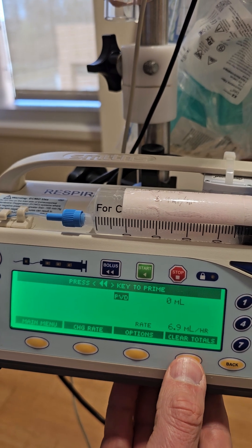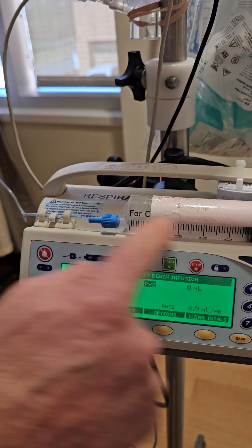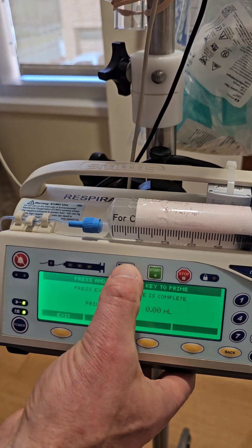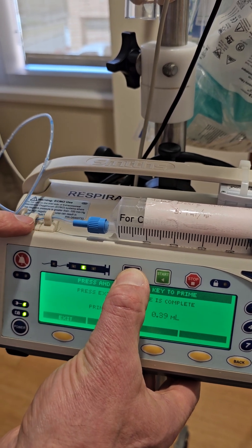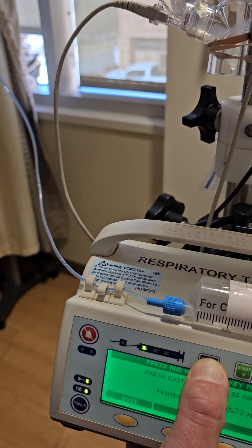Now we're ready to prime the line. There's just air in this line and we want to fill it with Flolan. We'll do that by pressing the bolus button once and then holding it down. While we're holding it down, we see these flashing lights and we should have Flolan coming through this line. We're going to pause again until we're almost done priming.